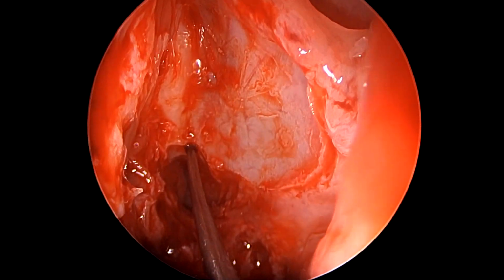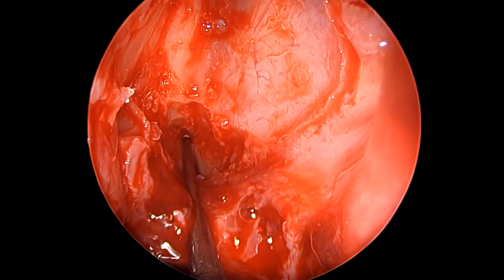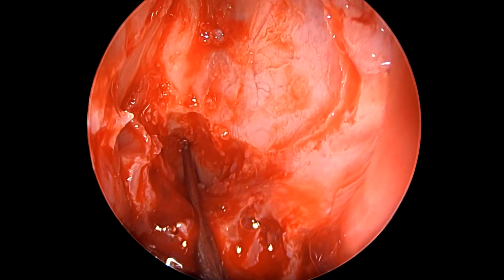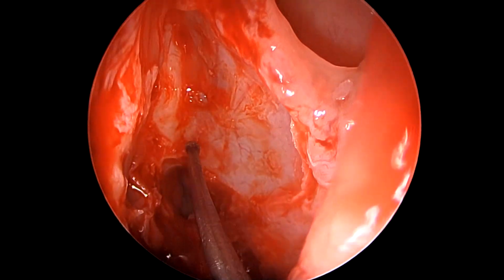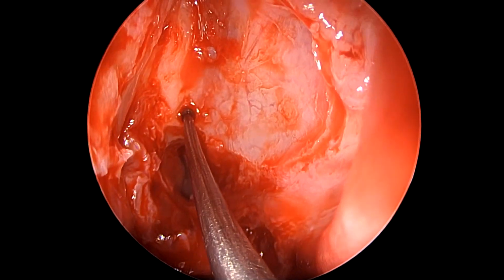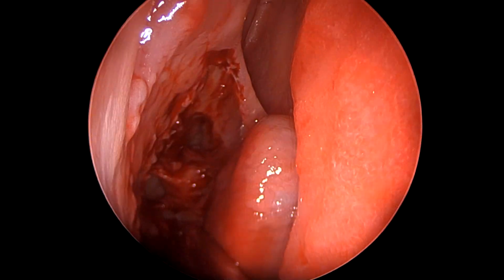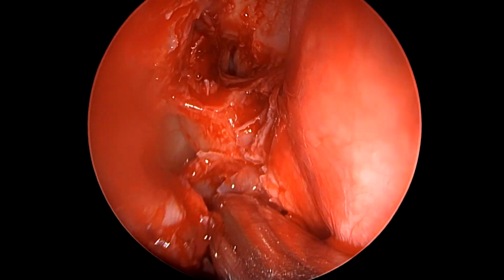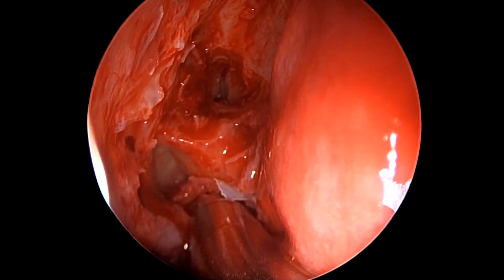We are working inside, under the axilla of the middle turbinate. And this, where the beak is going, is not actually the frontal sinus, though it might look like it. It's still a type 3 cell. It's not a suprabullar cell, this is a type 3 cell. So we still need to move anteriorly to be able to work our way inside the frontal sinus.